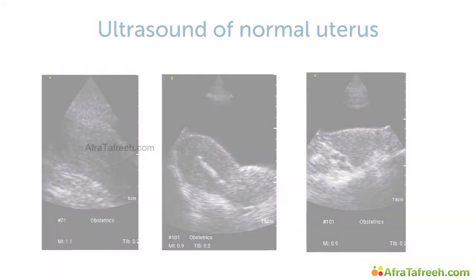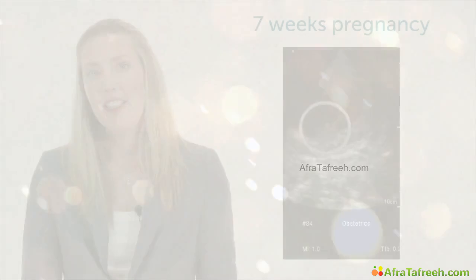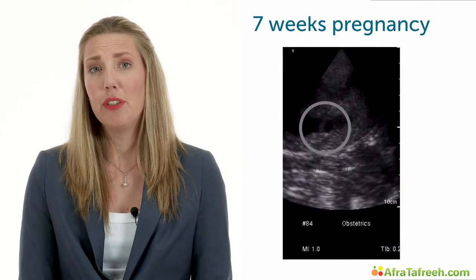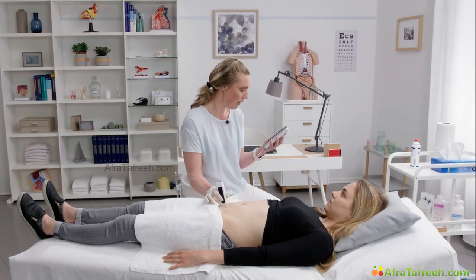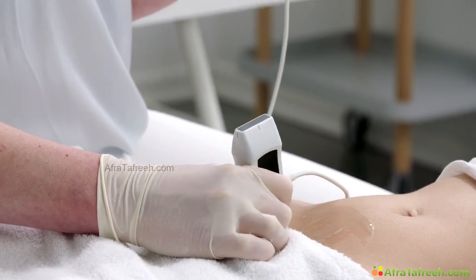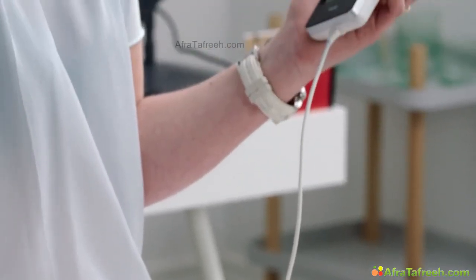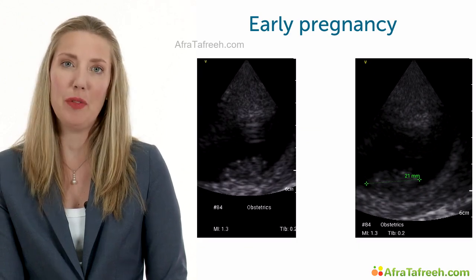Visualization of the uterus and ovaries provides us immediately with a lot of the information needed. In the following lecture, Patricia Costa, sonographer and owner of EchoTune, a primary care obstetric ultrasound practice in the Netherlands, will explain how ultrasound can be applied in a primary care setting. Here you will learn to image the female pelvis and to examine the early pregnancy.